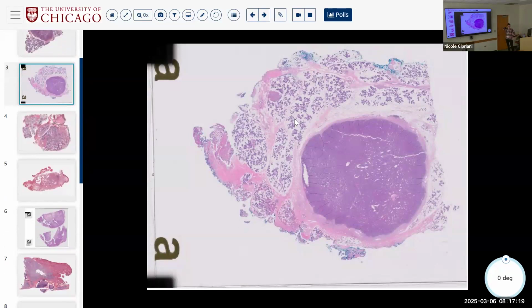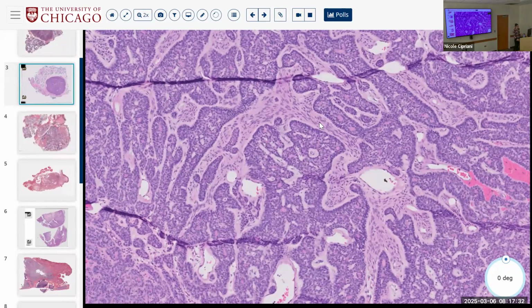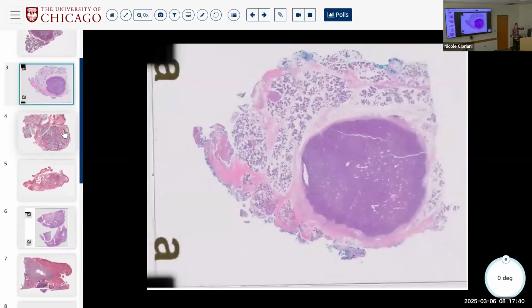Mutations in CTNNB1, beta-catenin, yeah, exactly. So you can throw a beta-catenin stain on here and see the nuclear expression. You could also throw your S100 on there and identify your spindled myoepithelial cell stroma. Otherwise, both PA, probably cellular PA, and BCA are all biphasic, and so they will all have that P40, C-kit distribution of epithelial and myoepithelial cells, with some differences in the morphology of those epithelial and myoepithelial cell compartments and stroma. Okay?